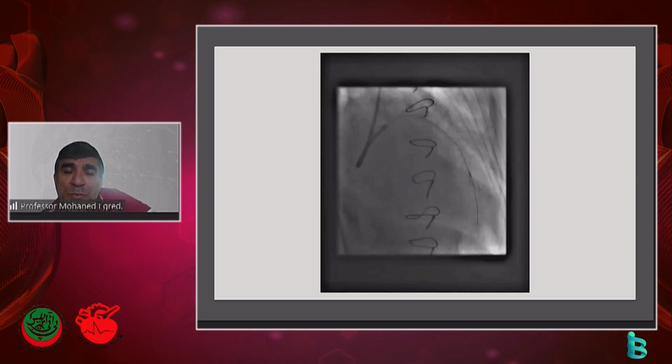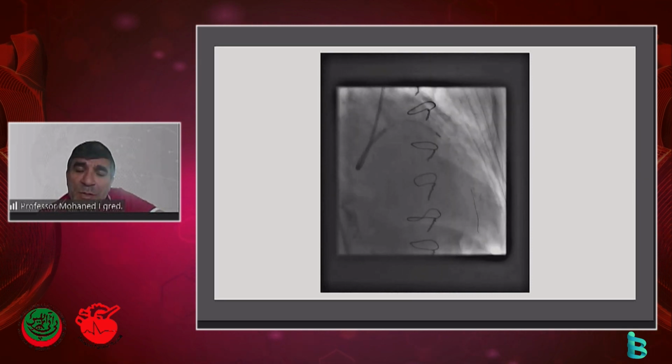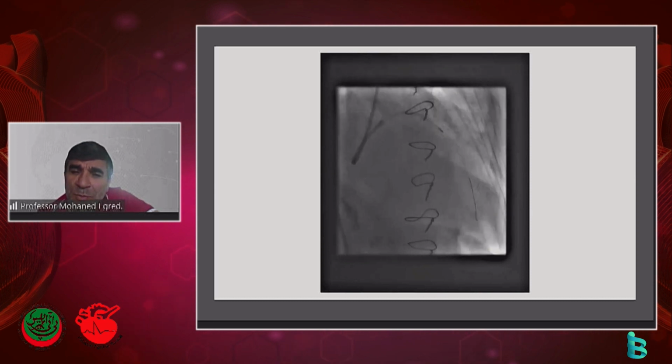Because with the soft wire or the floppy wire, you have to be careful around bends, and you have to be careful around resistant lesions. If you've got the floppy wire and you're pushing with the burr, which you shouldn't, but sometimes with a resistant lesion the tendency is to try to push a little harder. The wire could bend and the burr will follow it and could perforate.